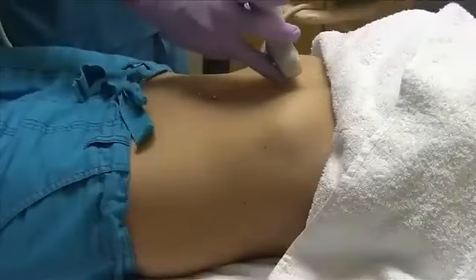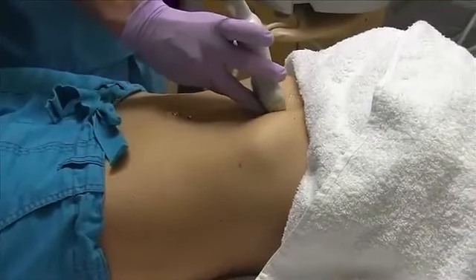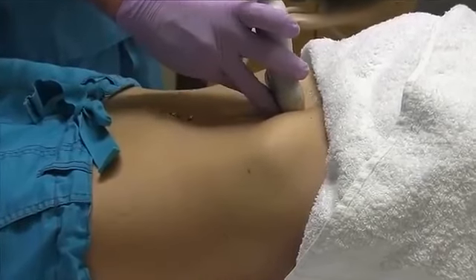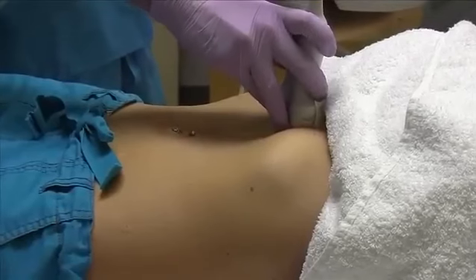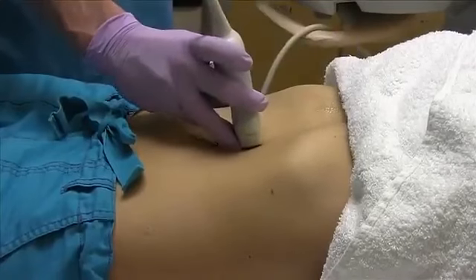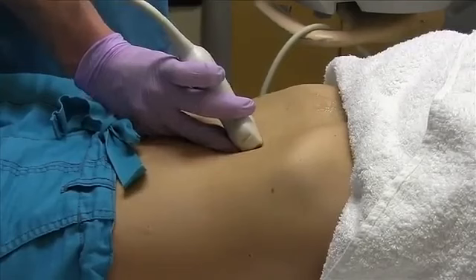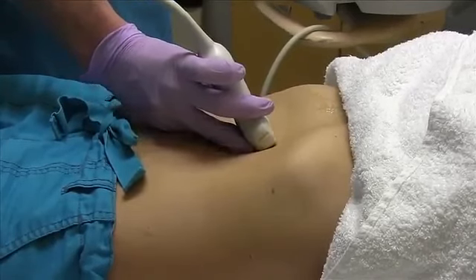To image the pancreas, which is what we're going to look at next, you want to come subxiphoid again, and what I would do is come up high and angle down. That way you're using the tip of the left lobe of your liver as your window, instead of coming down low and angling up, where you're going to use bowel, which is never a good scan window in ultrasound.